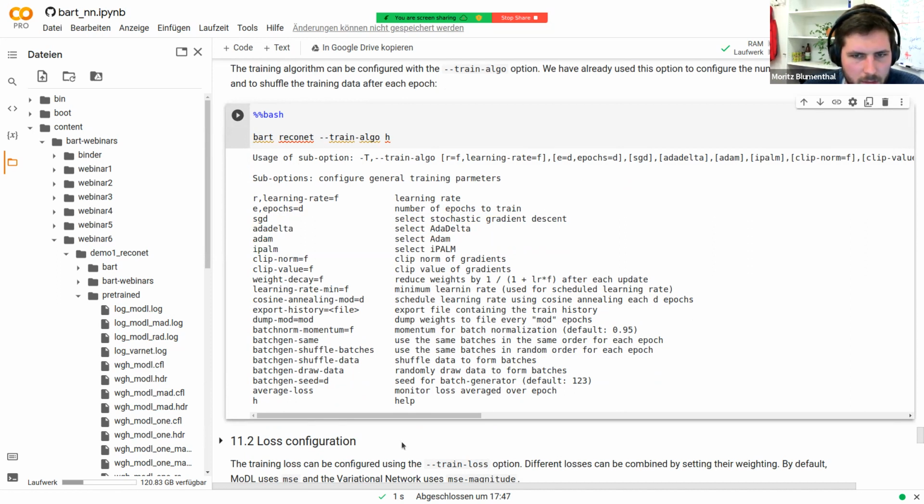Another question was about memory mapping. If you don't have enough RAM, then memory mapping will load partially. And there was a question about how this might work with other tools other than Reconet. And Martin answered in the chat that it will do its best to load what it can, as long as it's not all being used for the same operation, but that might slow things down.